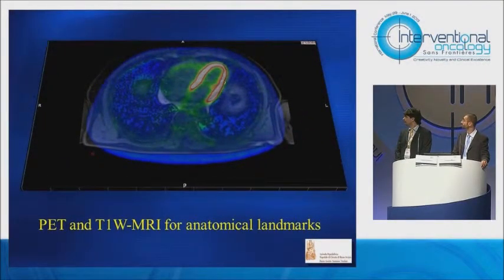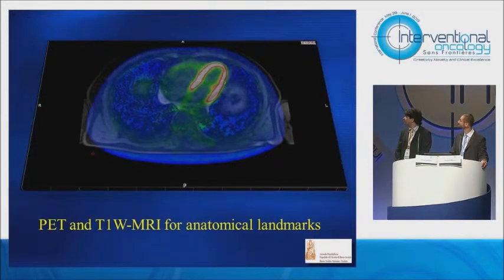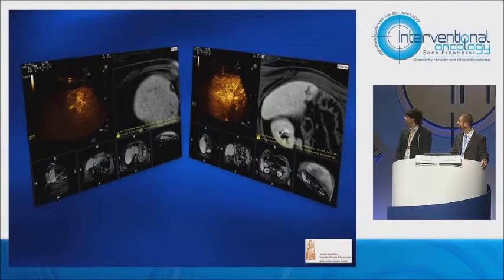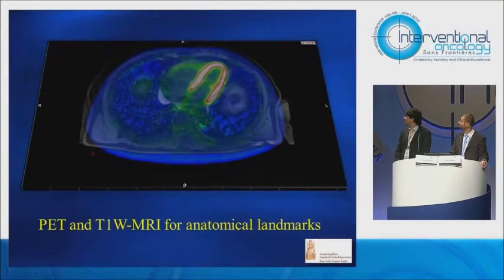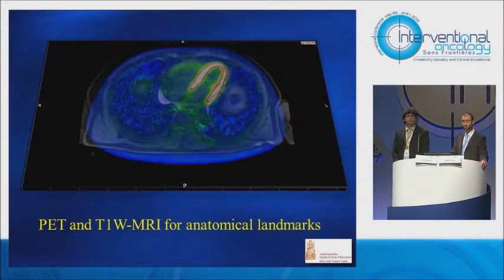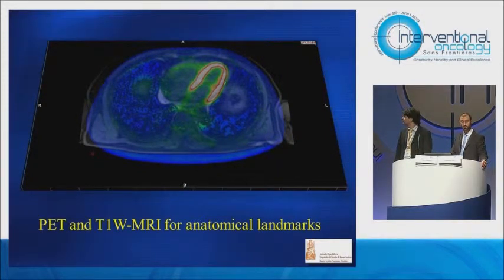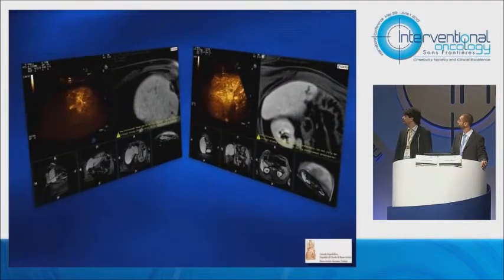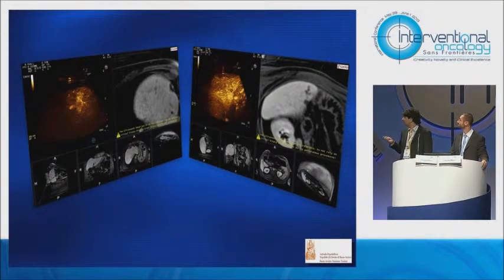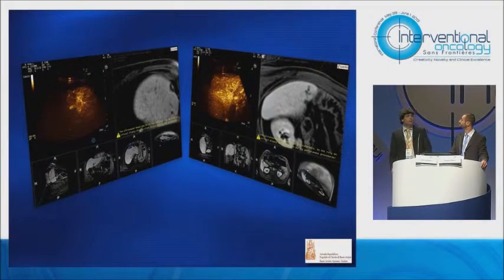This is a case where we fused together PET and MRI, because PET was showing exactly where the lesion was. We fused MRI and PET together in order to take the landmarks of MRI for future fusion with ultrasound, and PET for the detection of the lesion. Here you can see, by fusing the MRI and ultrasound, the correspondence of vessels and anatomy.